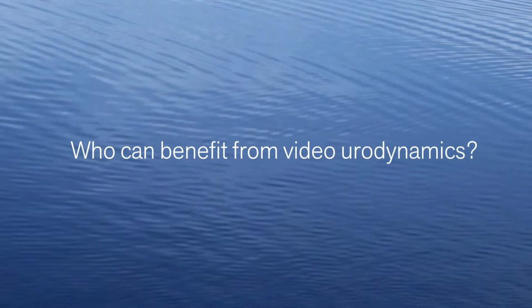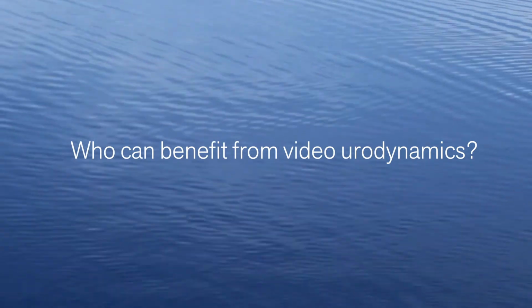For urodynamics, patients that we're really looking for that need that video component are those that have difficulty urinating and they're not sure why. They feel like there's some sort of obstruction. It also is very beneficial in people that feel they have overactive bladder, and their bladder is making them pee too much and they feel like they have a strong urge, and it's not really clear as to what the etiology might be.